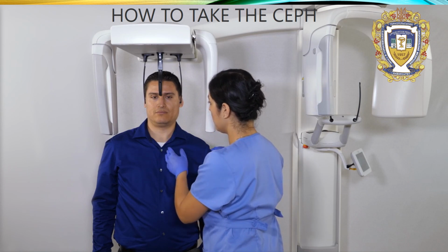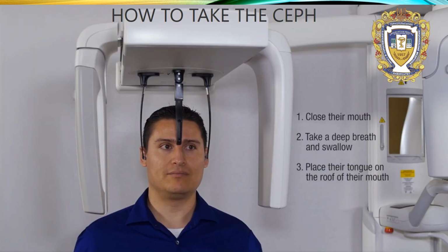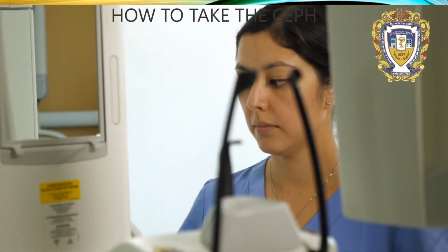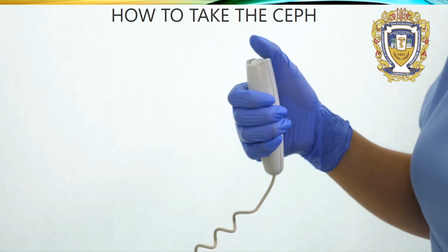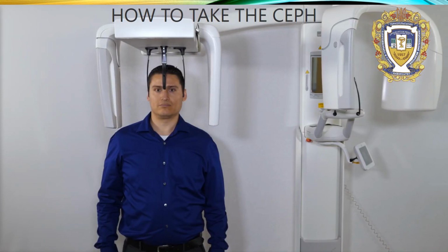With the patient properly positioned, ask the patient to close their mouth, take a deep breath and swallow, place their tongue on the roof of their mouth, then remain as motionless as possible until the device stops moving and they are instructed on what to do next. Step back at least 2 meters, 6 feet, away from the Vantage system, but not toward the patient. And press and hold the exposure button until the Vantage system stops moving.